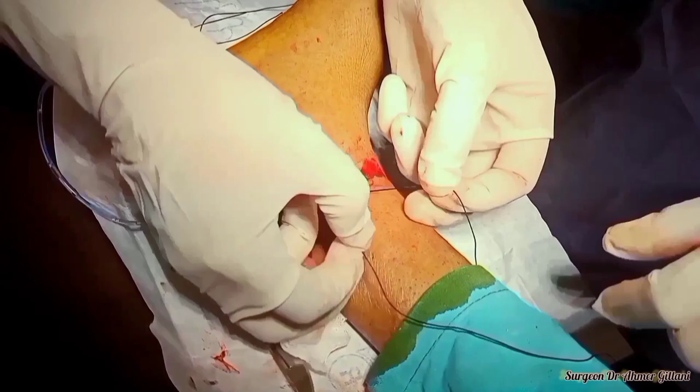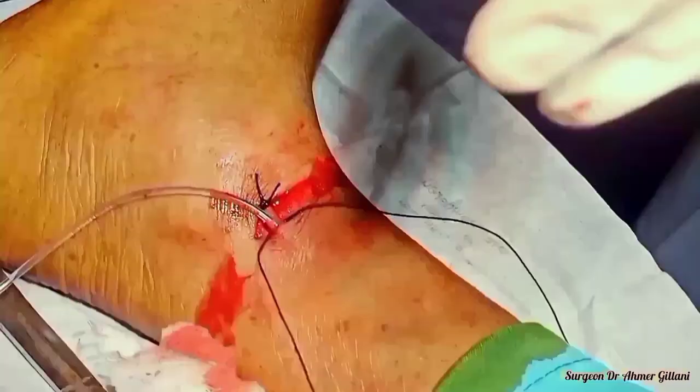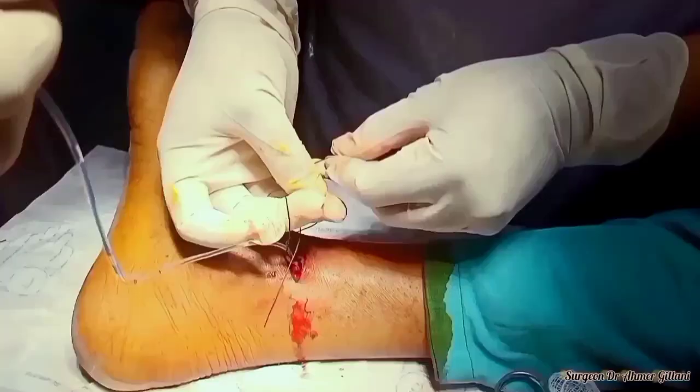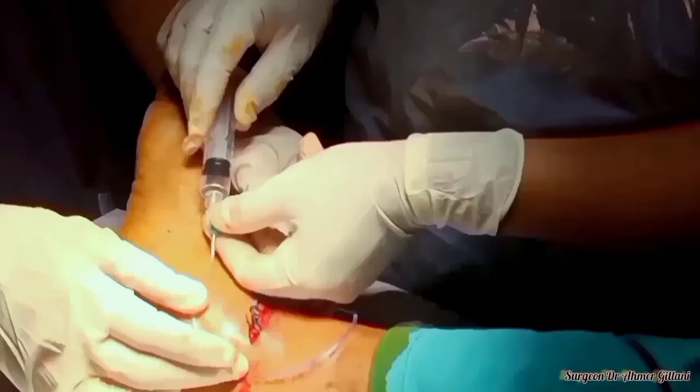In this video, we are using the long saphenous vein in this patient as the access point for the venous cut down. It is also known as the long saphenous vein section, or the venous cut down. Simply, it's a beautiful procedure and every junior surgeon and every junior doctor must learn this. We are again checking the access — thank you so much.